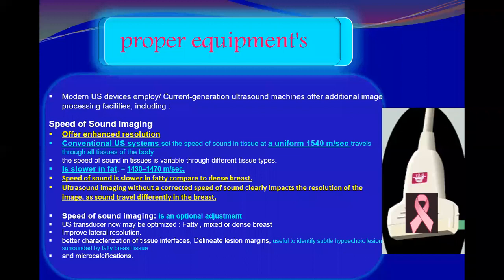One technique is speed of sound imaging. What is speed of sound? As you know, the speed of ultrasound varies according to the tissue of the body. You agree?